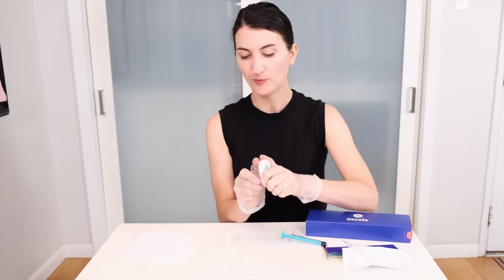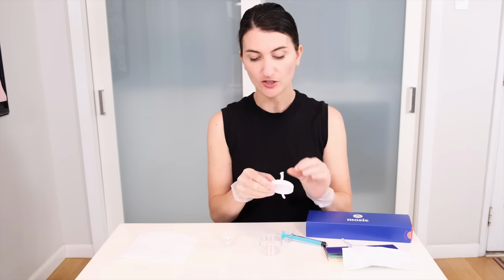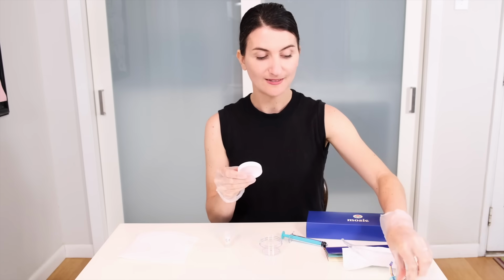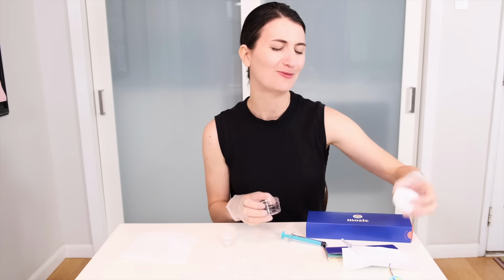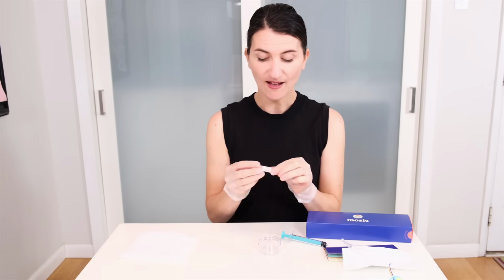We'll crack this open. If you were using a known donor and you needed to travel, or you're using your husband, your partner, your spouse, I'm taking that sticker off there. You could travel with this if needed, but today we don't need to travel, so we're okay. I'll set that down.